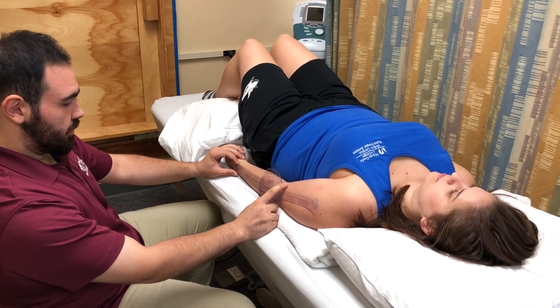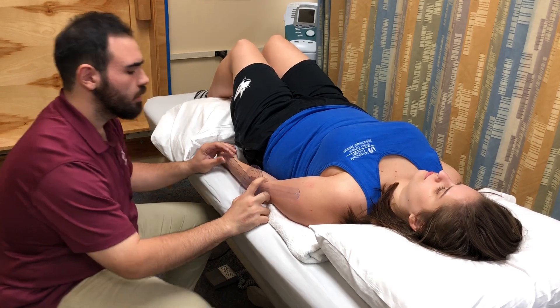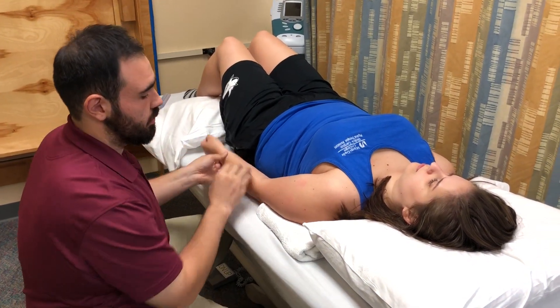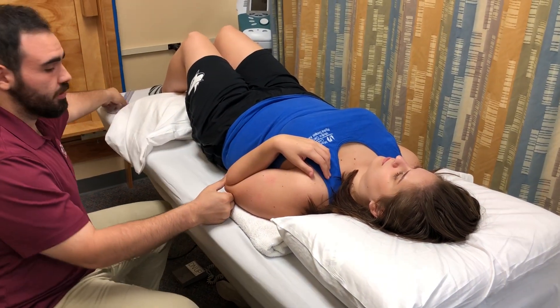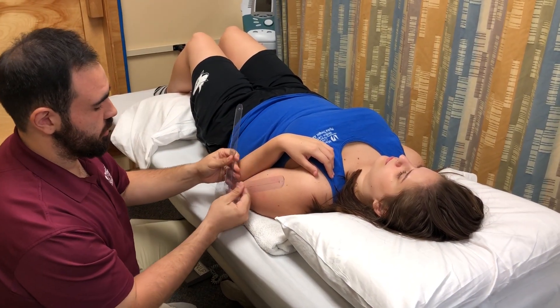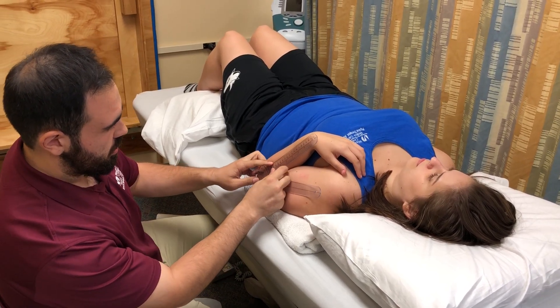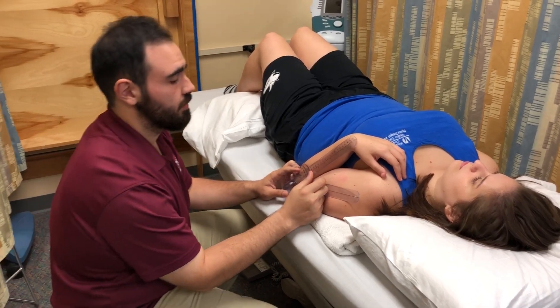I'm going to record the range of the starting position. In this case it is zero. I'm going to remove the goniometer and I'm going to perform passive range of motion. I'm going to realign the goniometer and I'm going to record the range. In this case, she's at 145 degrees.